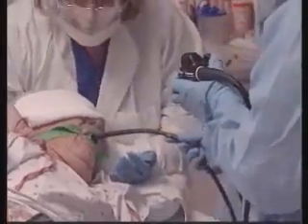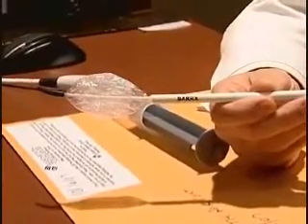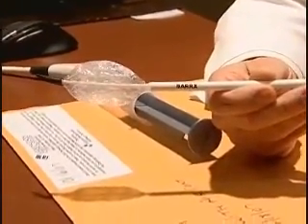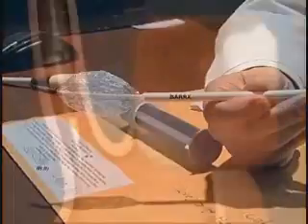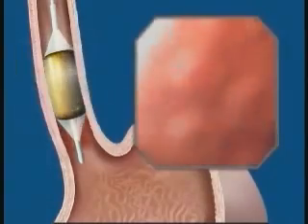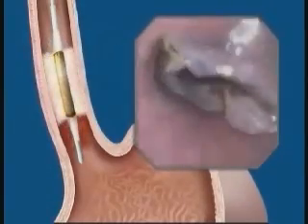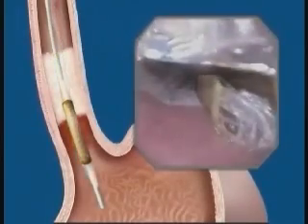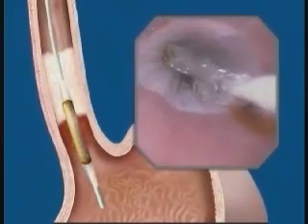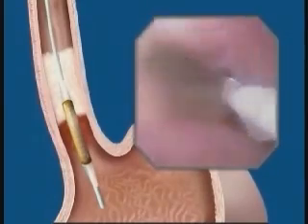Now, surgeons have a non-invasive way to eliminate potentially cancerous cells in the esophagus. What it does is take a balloon that's inflated into the lower part of the esophagus and using computer-generated equipment, deliver just the right amount of radio frequency to develop heat to destroy, in a very controlled fashion, the very most superficial lining, less than 1 millimeter deep, so that you destroy the cells that line the esophagus, the Barrett's, without destroying the underlying normal structures.